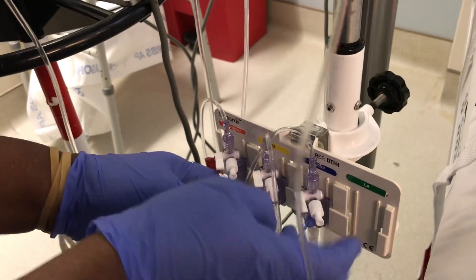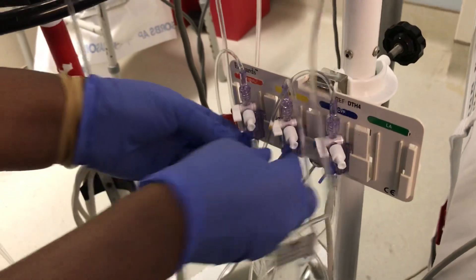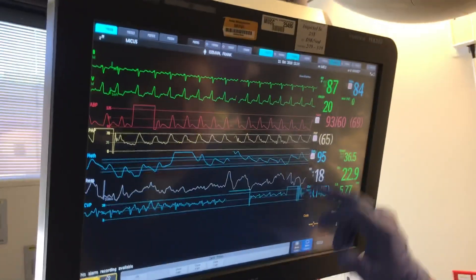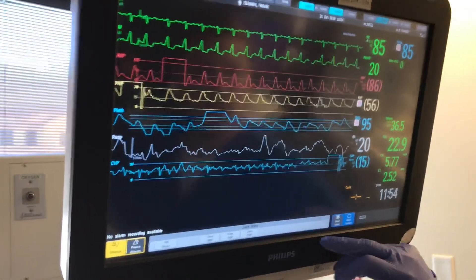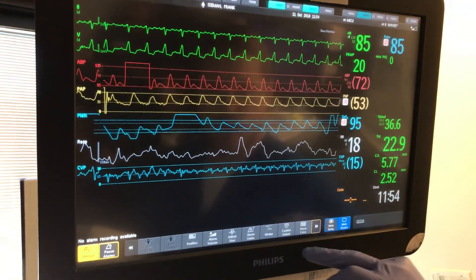This here — I was just telling Ethan — this hub has got to be up. I'm flushing everything. I'll just do the vision. Now from this screen, we're going to do our wedge first.